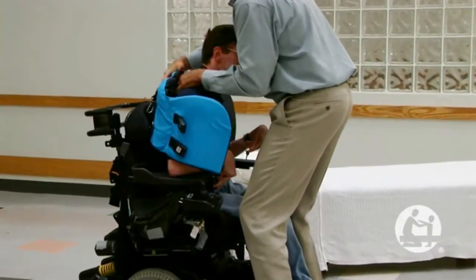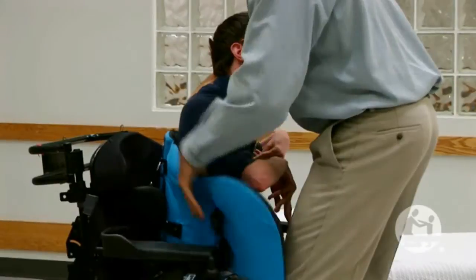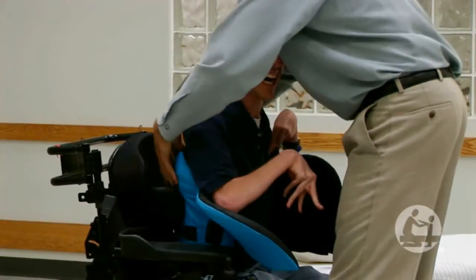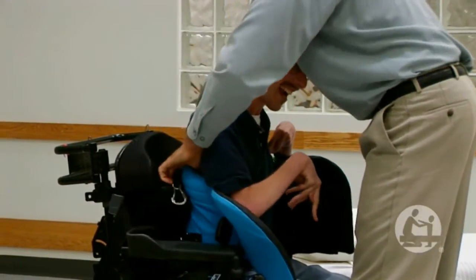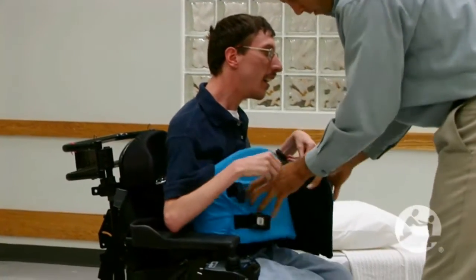The client only has to lean forward a slight bit to get the vest behind them, and it straps on in front — that's all that's really needed of them. When using other lifts and slings, you have to really maneuver the participant around, sometimes in an uncomfortable position, to get the sling under them to use it. With the vest, you just slide them forward a little bit and you can just stick it behind them, and it works out much better.